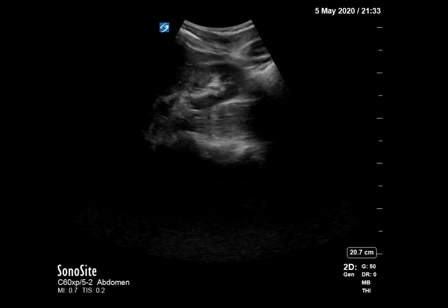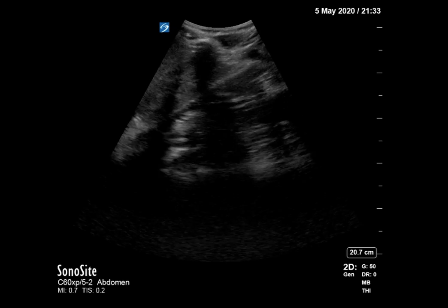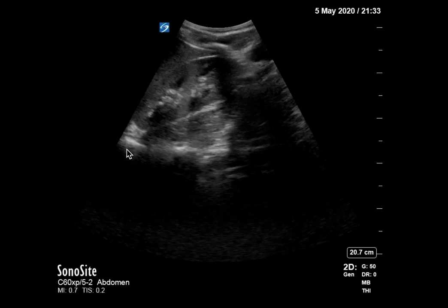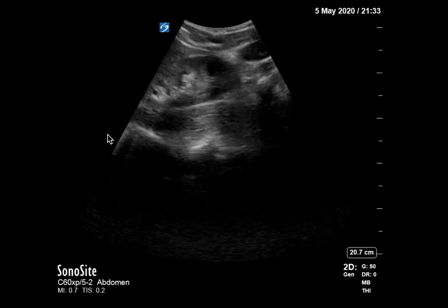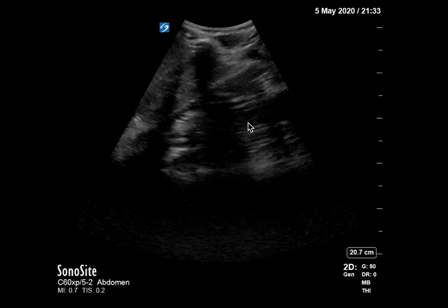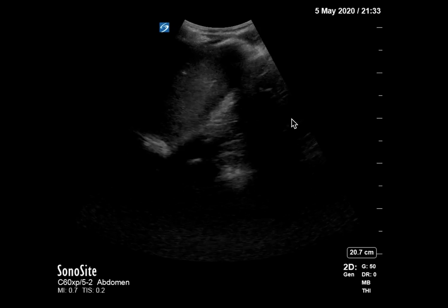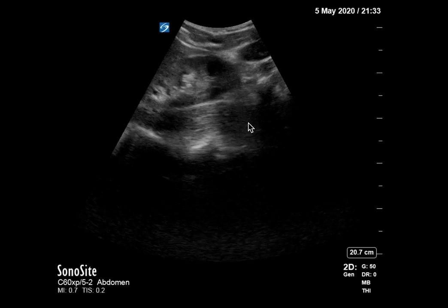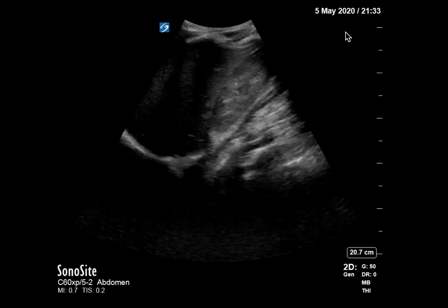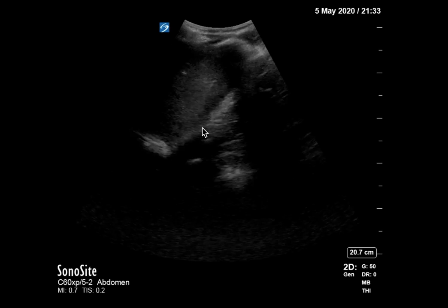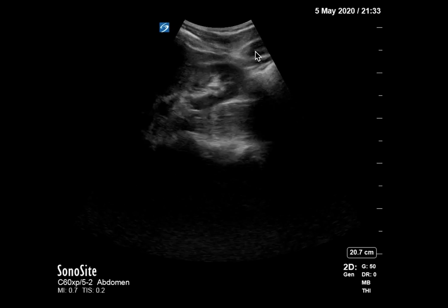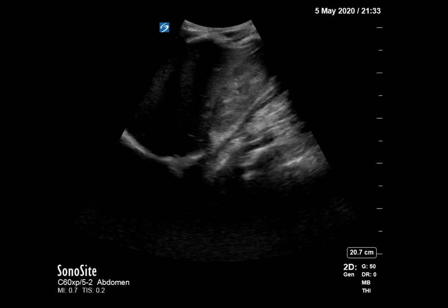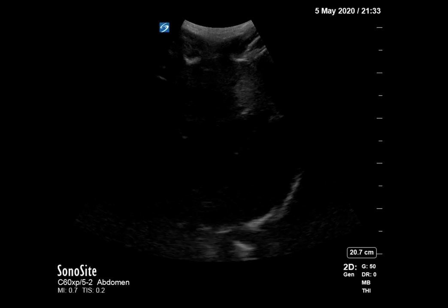Then we viewed the right upper quadrant. You can see scanning through the kidney there and the liver right here. We can see the thorax on that side — we don't see a big hemothorax. This is your psoas muscle back here, which is part of the retroperitoneum, so you shouldn't see any free fluid back there. We're also visualizing Morrison's pouch and the inferior pole of the right kidney, which is the pericolic gutter — that all looks negative as well.